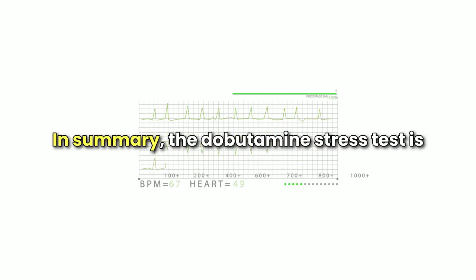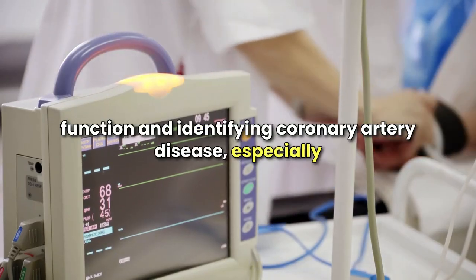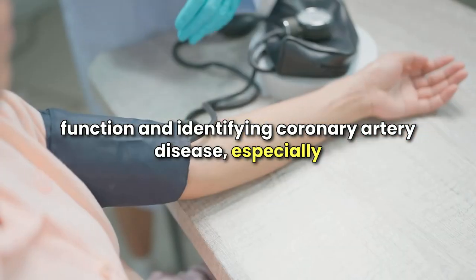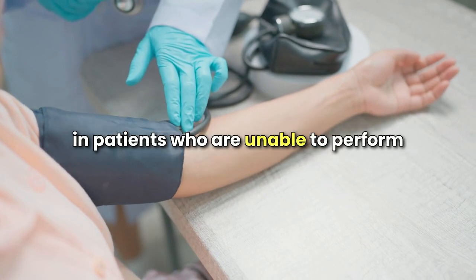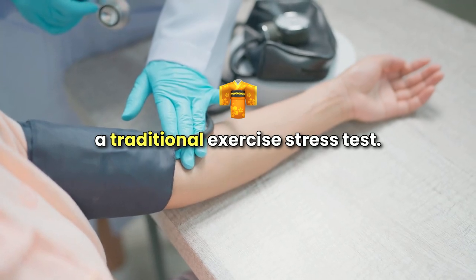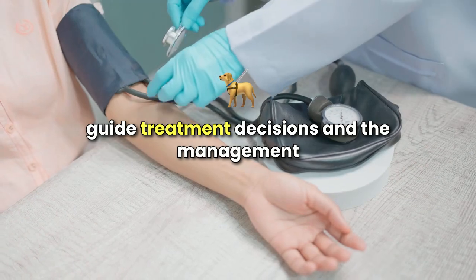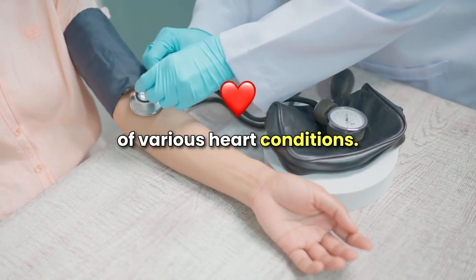In summary, the dobutamine stress test is a valuable diagnostic tool for assessing cardiac function and identifying coronary artery disease, especially in patients who are unable to perform a traditional exercise stress test. It provides critical information that helps guide treatment decisions and the management of various heart conditions.